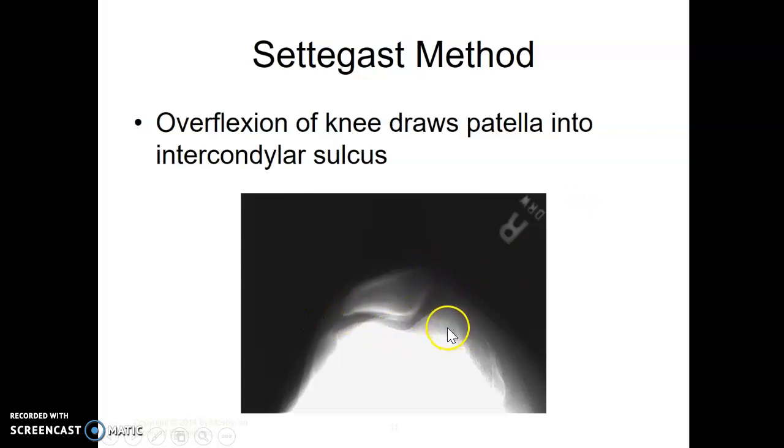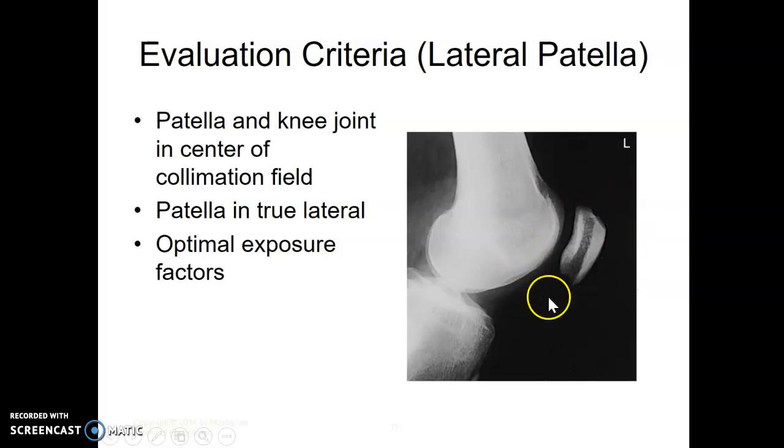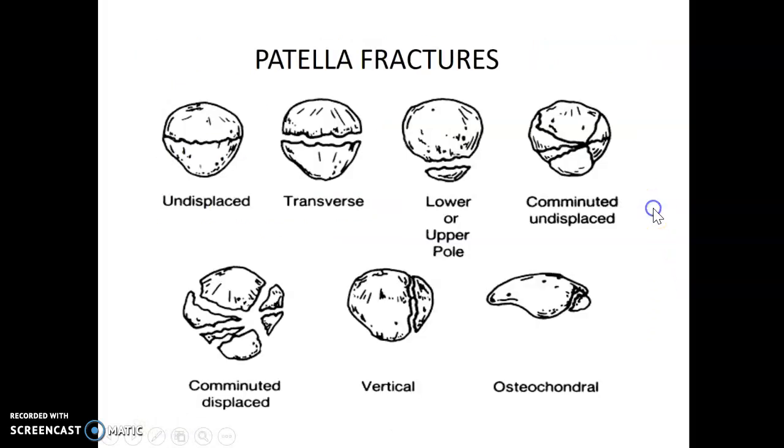If you overflex the knee, can you see where these are superimposed now? So too much of a bend actually closes it. So don't go too crazy. Your textbook identifies a lateral patella by itself. We do not do this routinely at our site, but it is in your textbook. So just kind of a collimated, tightly lateral knee, if you will.